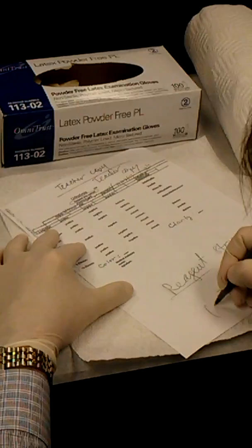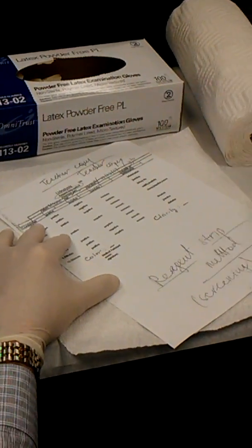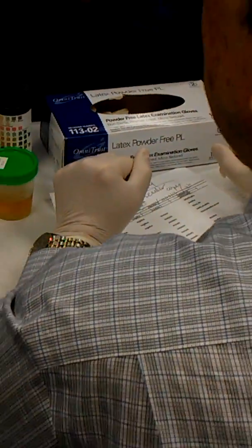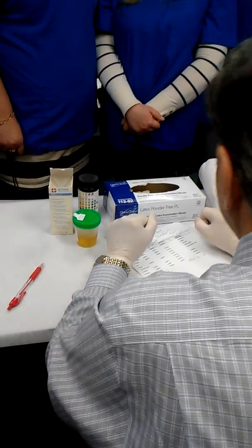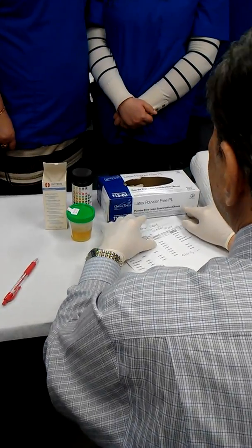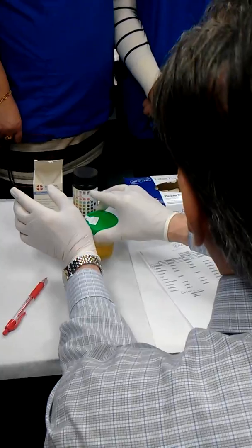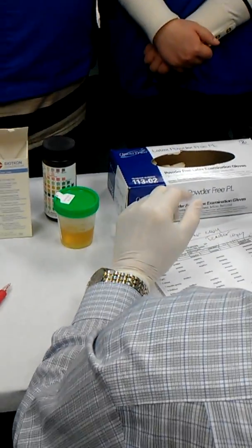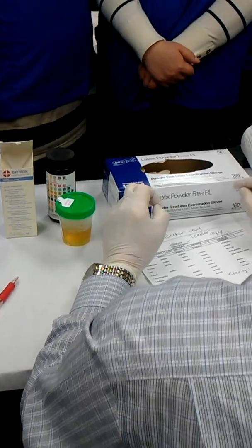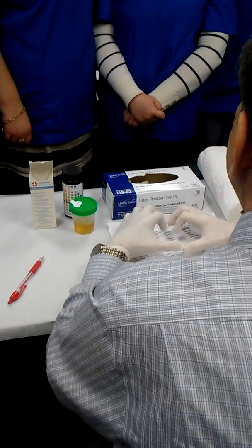What does screening test mean? Screening test means that it's easy to be done. Every day, a medical assistant is doing this test, that's number one. Number two, it's very cheap. That's why we're doing it widely for every patient complaining of a problem with the urinary system. And it's not expensive. That's why we're doing this every day.